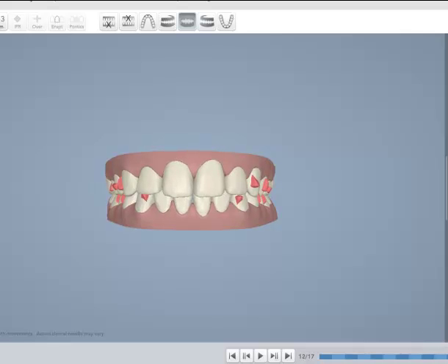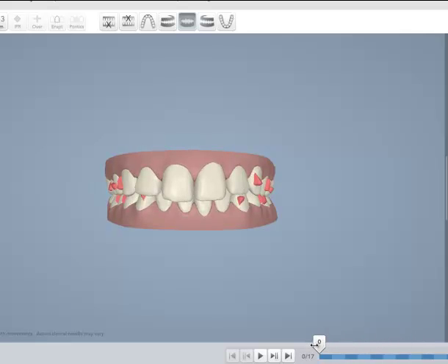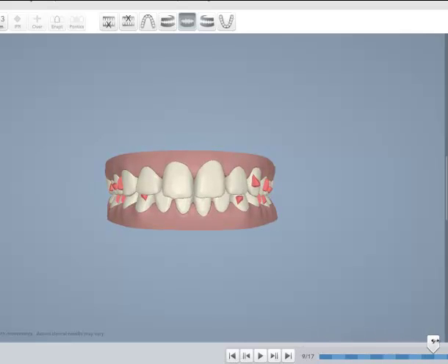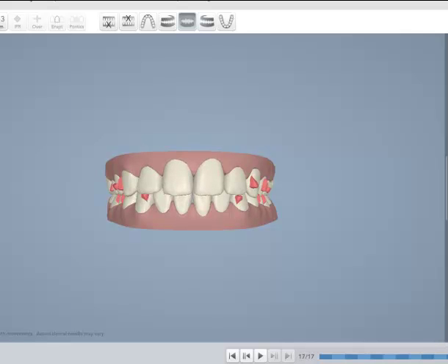The incisors are being slowly intruded and there's not much expansion of the arch. The arches are not really expanded; we didn't need to expand them. By intrusion you get the overbite and overjet correction.